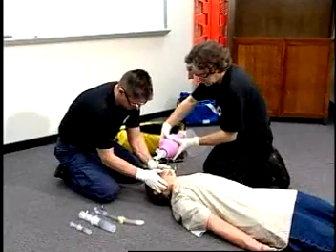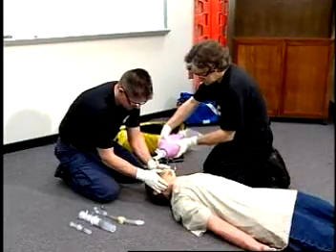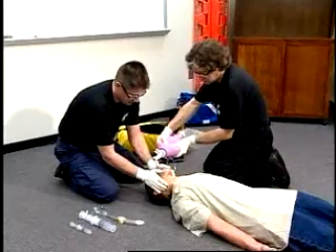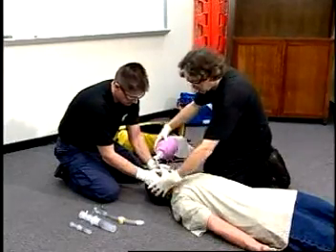Provide supportive ventilations as needed. Pre-oxygenate the patient using a basic airway maneuver and maintaining neutral inline stabilization. Inspect and prepare the equipment as the patient's ventilations are being assisted.